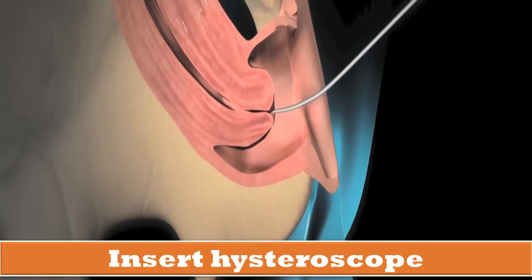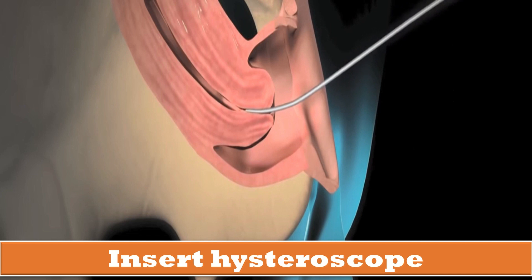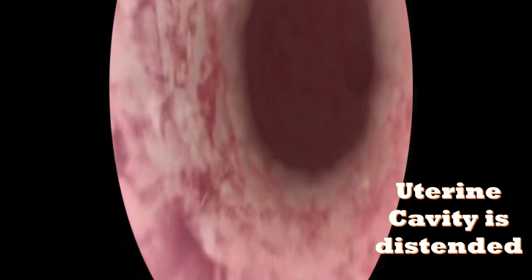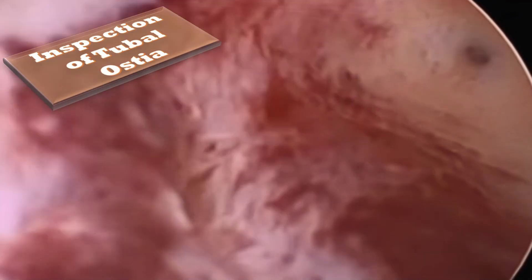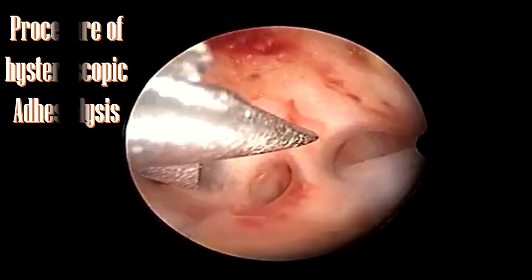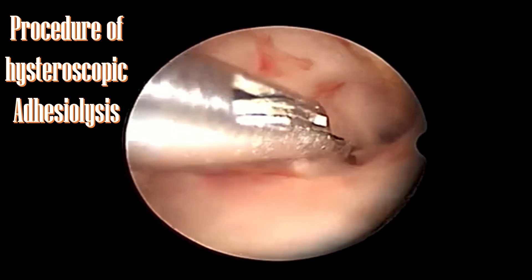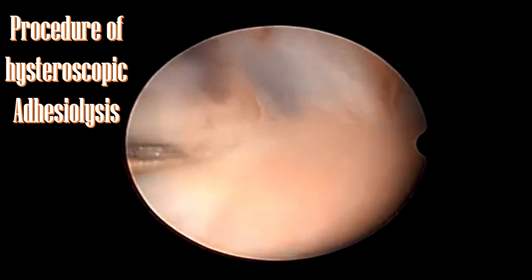First, insert the hysteroscope. Then the cavity is distended. We do inspection of the tubal ostia. The hysteroscope is equipped with a light source and camera that allows the surgeon to visualize the uterine cavity on a monitor.